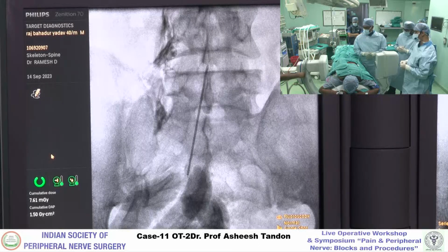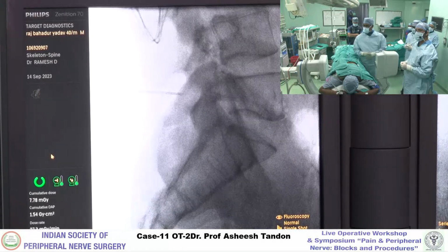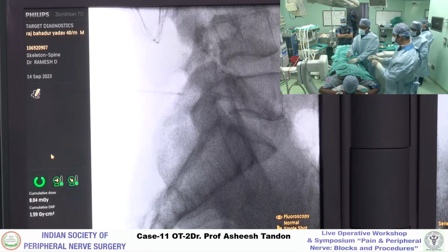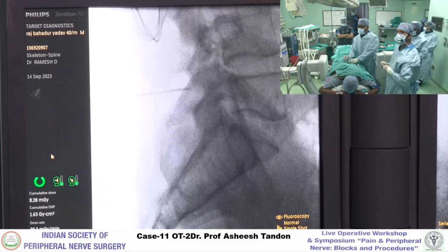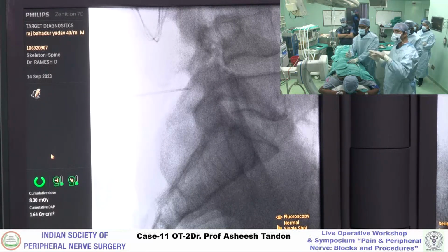हाँ, ठीक. कर लो नीचे थोड़ा. हाँ, okay. Good. What I'll suggest is just go a little like this. एक shot लेना please. Yeah, this is better. Go. मतलब थोड़ा higher up.